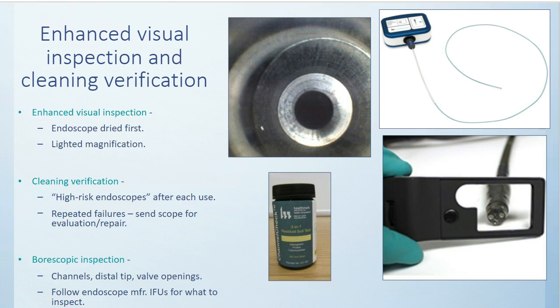That's those that have been determined to have issues, as well as those that are determined by the facility to be in the category of high-risk endoscope. Borescopic use is presented as a possible supplement to enhanced inspection, especially for channeled endoscopes and distal tips and valve openings. Next slide, please.